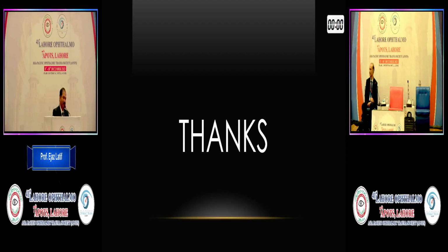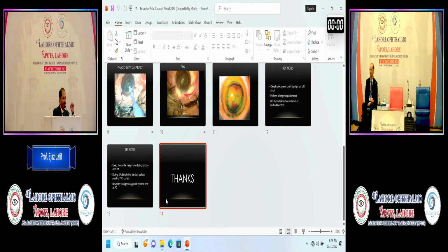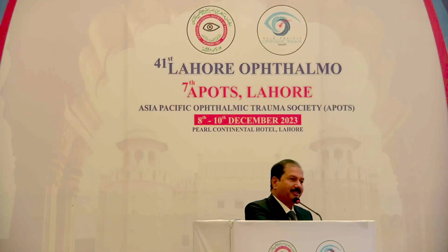A lot of cases of posterior polar cataract, and a rent is very, very rare, and it always happens when I ignore hydrodelineation. I don't remember, I was thinking something else, and I have gone to hydrodissection, and the rent occurs. In the very beginning, you see that the pressure is high inside, and the lens is pushing forward. So we can definitely implant the lens, because this happens very rarely, not in all cases. Maybe 1 in 20 cases of posterior polar cataract.